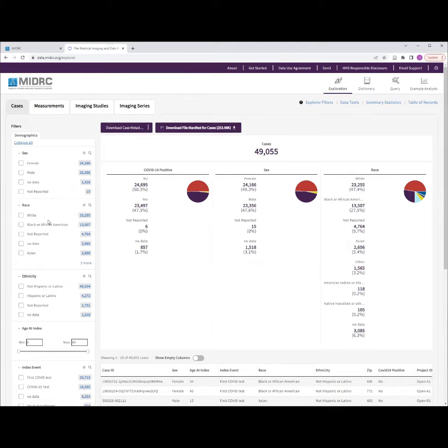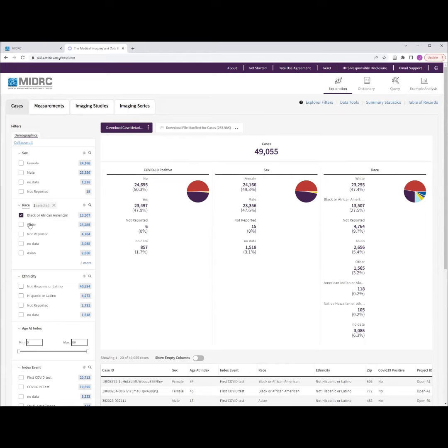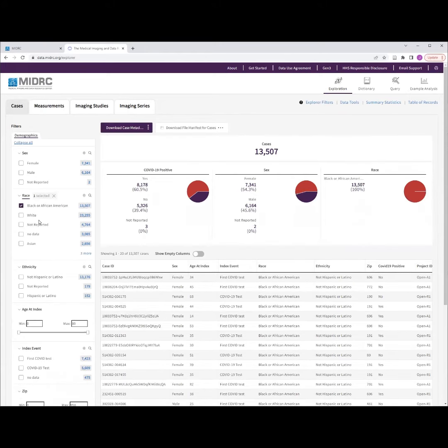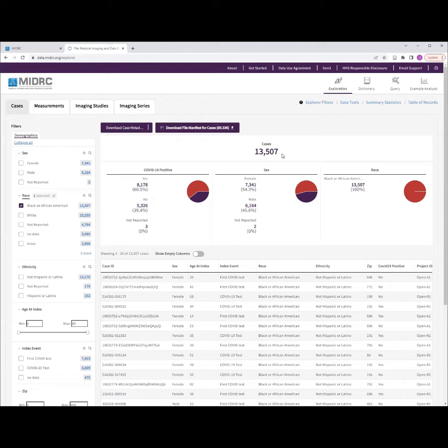For example, if my research question involved evaluating the generalizability of a machine learning model to a cohort of Black or African American patients, then I could select this characteristic on the left side of the screen, and we can see the selected cohort is updated in the center of the screen to reflect the 13,507 cases which fit that criteria.